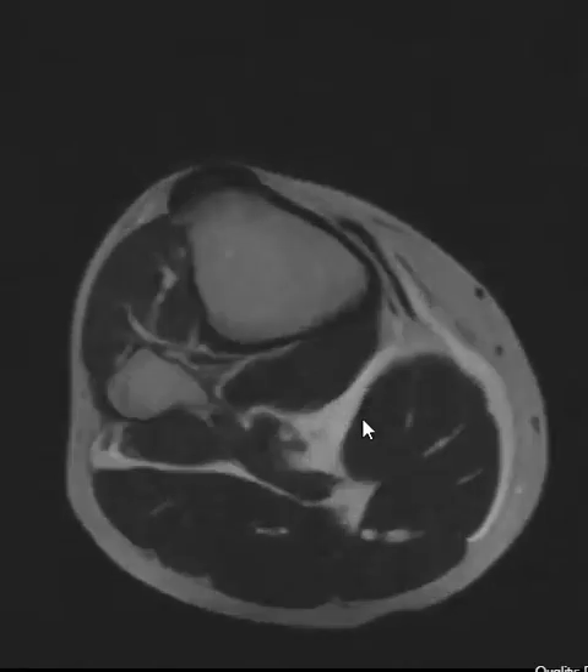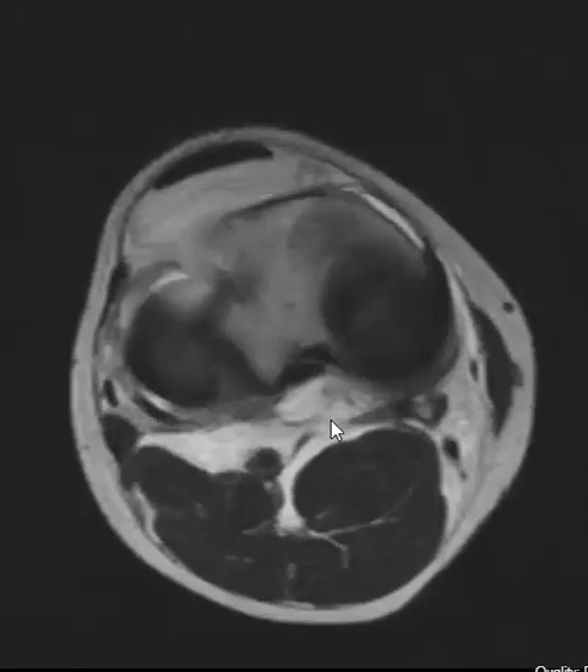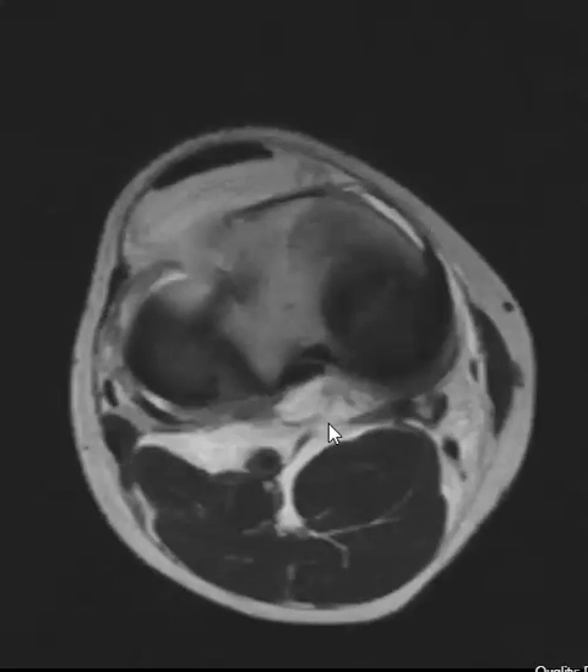So we're trying to find the etiology for that. We're going to look up here on a sagittal image in a minute. But right here you can see that there's a defect, a communication between the joint and the fluid collection back here. So it looks like a ruptured posterior joint capsule.